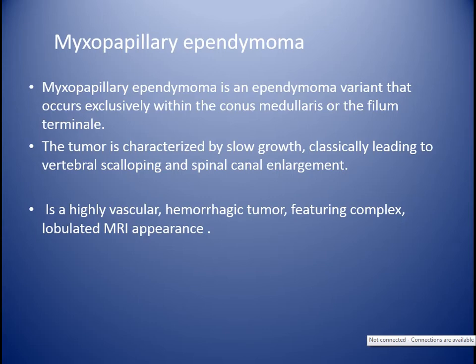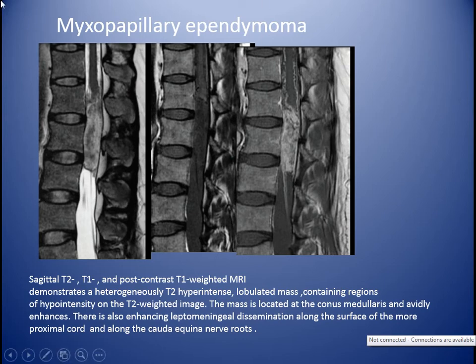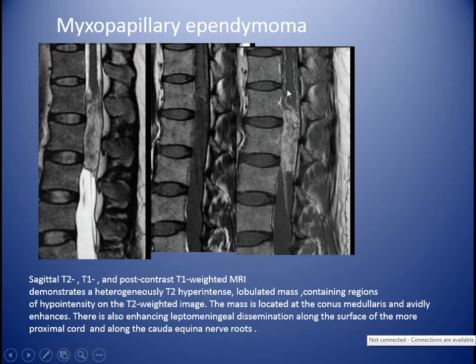Myxopapillary ependymoma is an ependymoma variant that occurs exclusively in the lower cord or conus medullaris and filum terminale. The tumor is characterized by slow growth, with classic scalloping of the vertebral body and spinal canal enlargement. It is a highly vascular hemorrhagic tumor with complex MRI appearance. Sagittal T2, T1, and post-contrast T1 show a lobulated complex hypointense mass on T1 located at the conus medullaris with enhancement and leptomeningeal dissemination along the cord surface and cauda equina nerve roots.